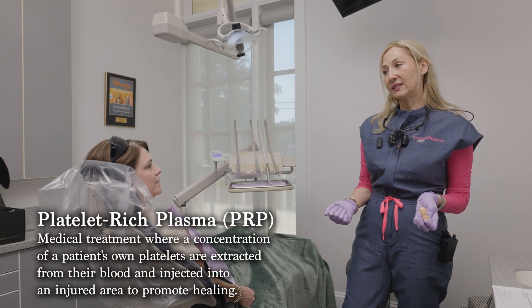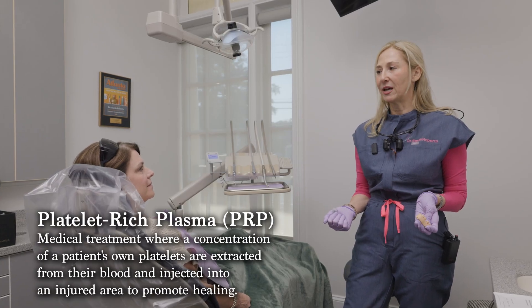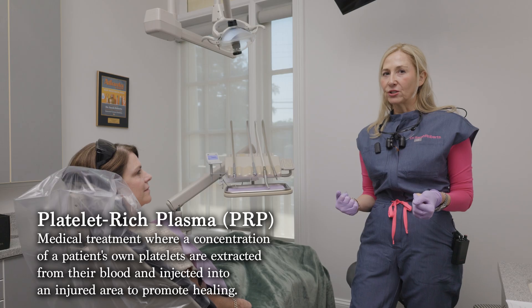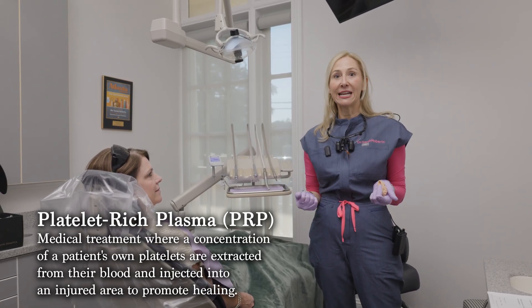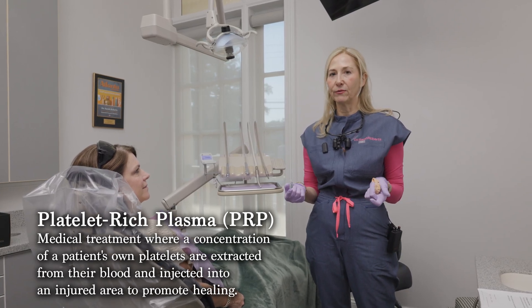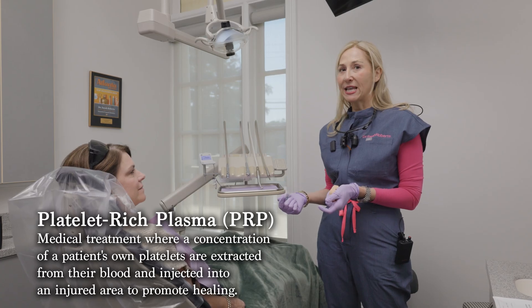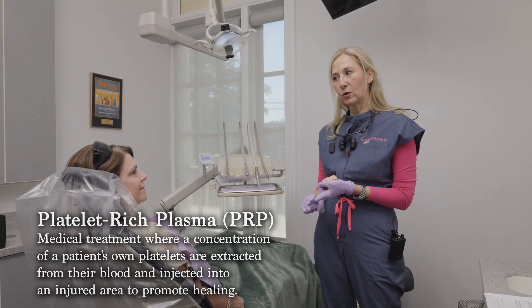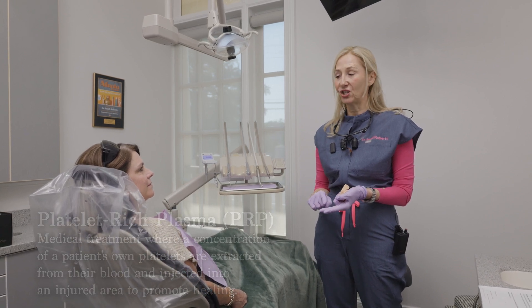PRP stands for platelet-rich plasma. It harnesses all the growth factors and special healing agents that your body uses to help itself recover and repair from injury. We can use that to help in our procedure so that she can heal more effectively and more completely with fewer complications.